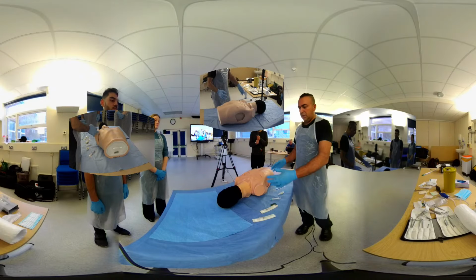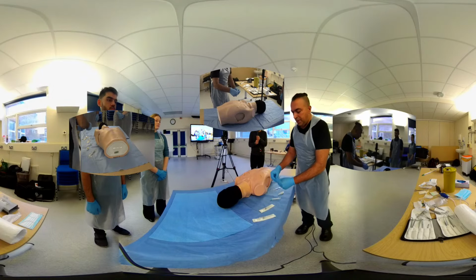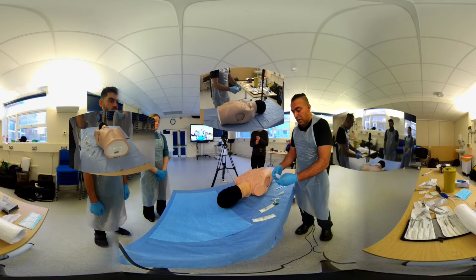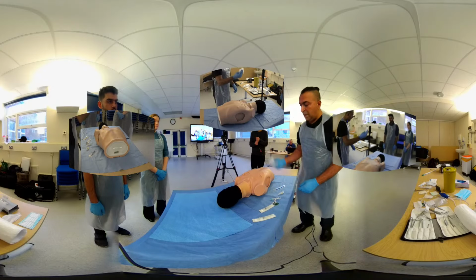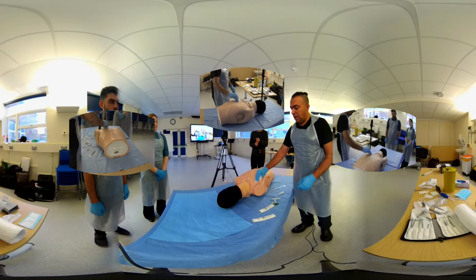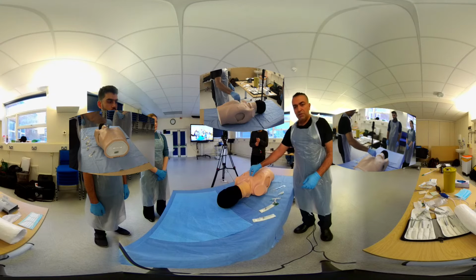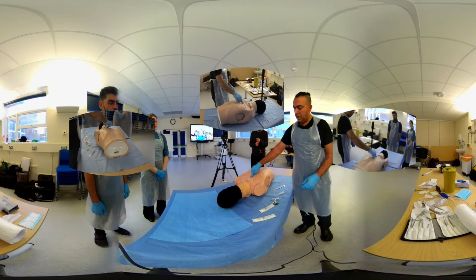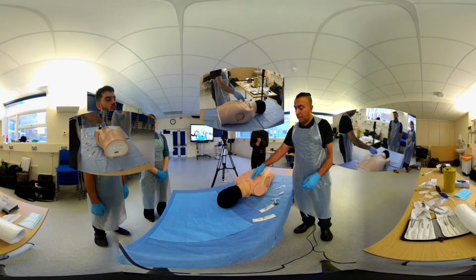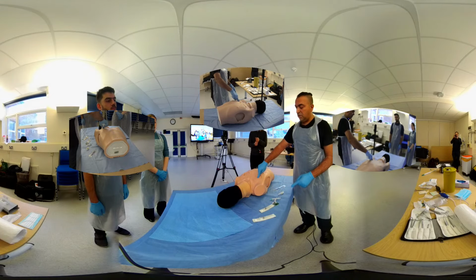Once you've got the patient in place, supine, you explain what you're going to do if they're conscious. You give them local anesthetic if they're conscious, just to make the area numb. You clean the area. I'm cleaning the area on the anterior chest wall, basically from the center, from where the sternum and the manubrium are. We're looking at the second intercostal space, and this is the mid-clavicular line. So your clavicle, mid-clavicular line, and the second intercostal space.